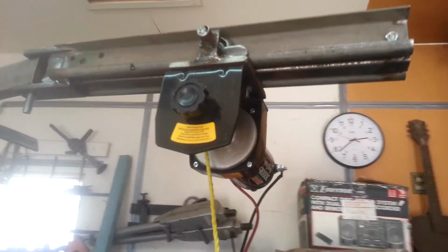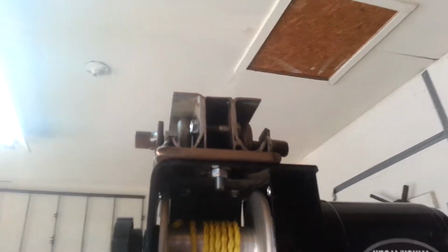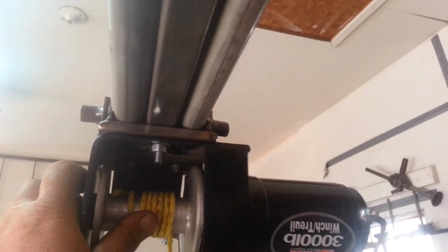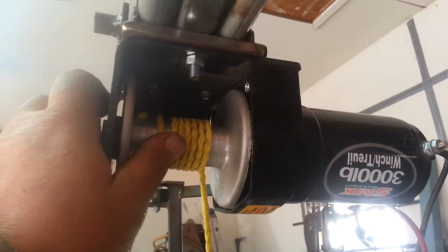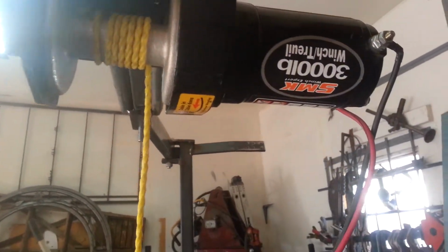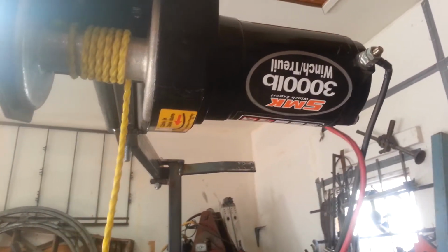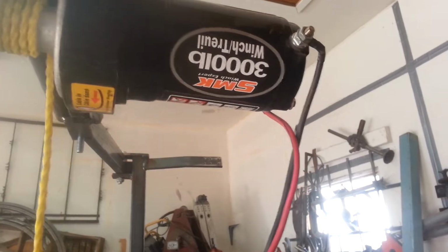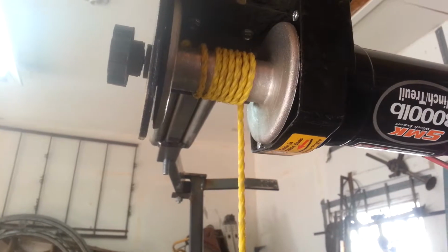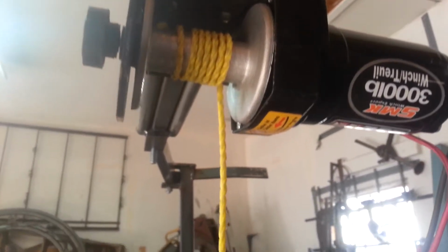Now what I did was, on the winch I made rollers out of a garage door track and the garage door wheels, so it'll slide back and forth to make it that much more universal. There's not a lot of room for this wheelchair to go in this van. The smallest winch I could find was this little 3,000 pound, but it was very inexpensive. I think it'll lift it. I got rid of the cable and put rope in because there's nothing but an issue with it binding, and the lady is not going to know how to contend with it.